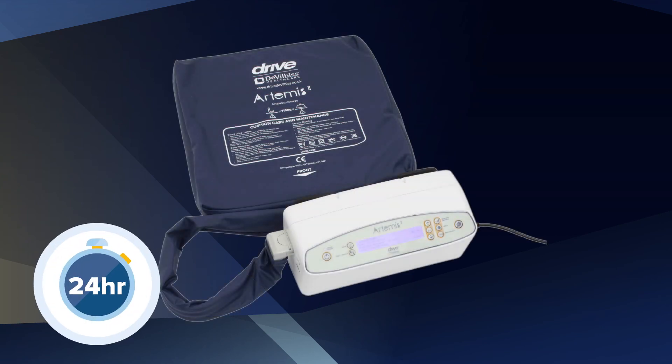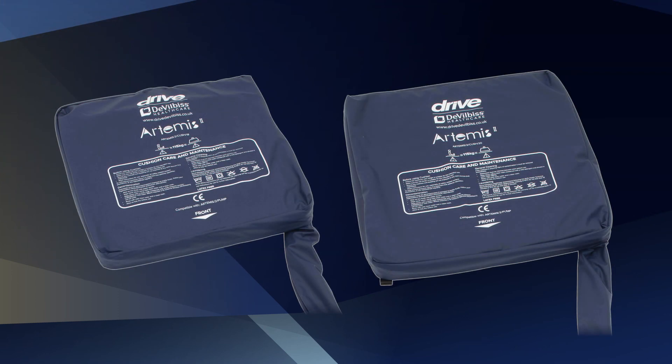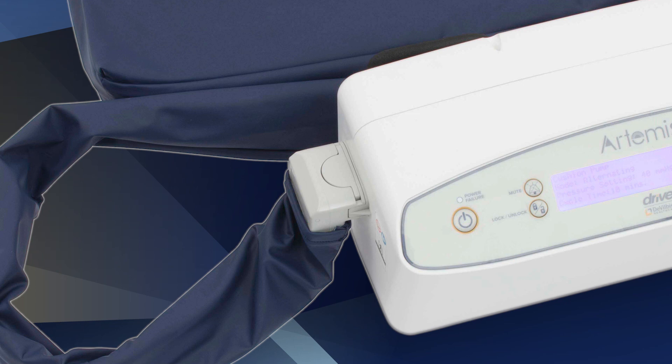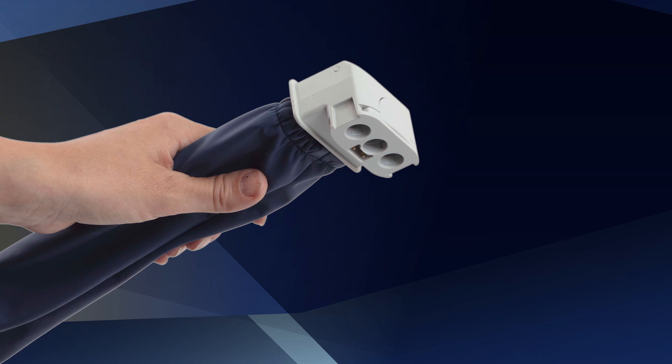The Artemis II cushion can be used as part of a 24-hour plan of care. Ensure the mattress is placed in transport mode so that it stays inflated whilst the patient is sitting out. The maximum patient weight is 115 kilograms or 18 stone. It has a 360-degree zip. There are two sizes: 18-inch and 20-inch. The 18-inch cushion has 9 cells and the 20-inch cushion has 10 cells. The chair cushion has straps that attach to a chair to avoid any slippage. Ensure the air connector tube set fits directly into the pump for inflation, using transport mode so that the cushion can remain inflated, allowing the patient to alternate between the mattress and the chair cushion throughout the day.